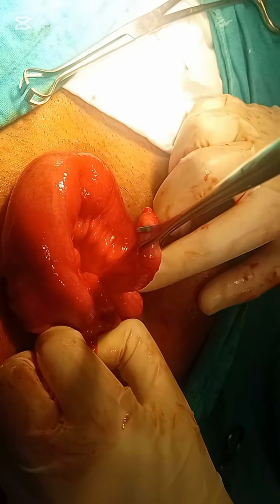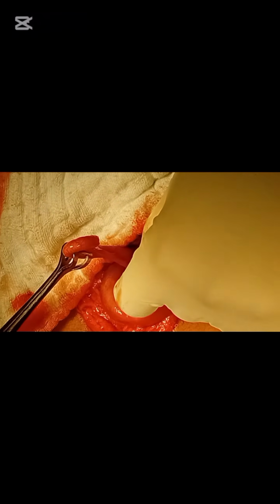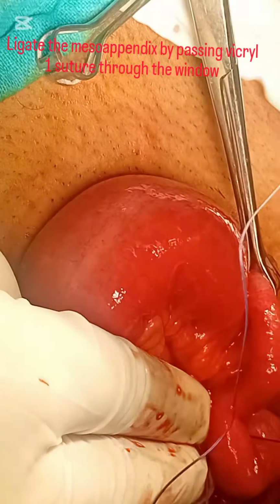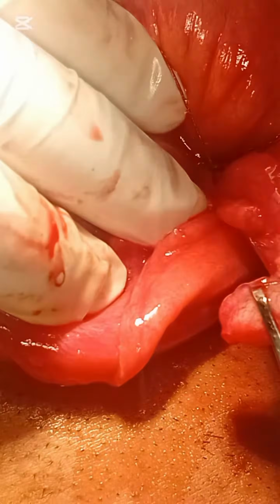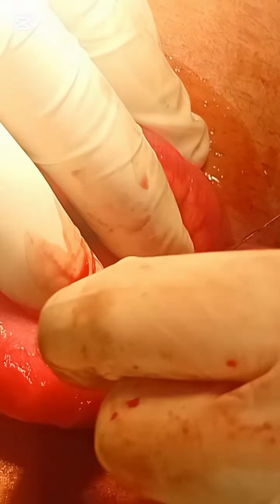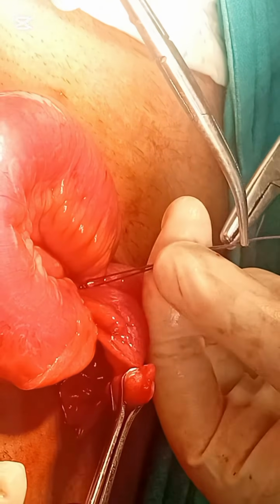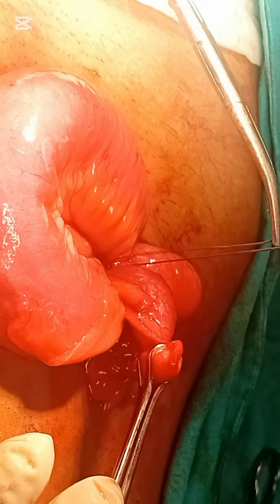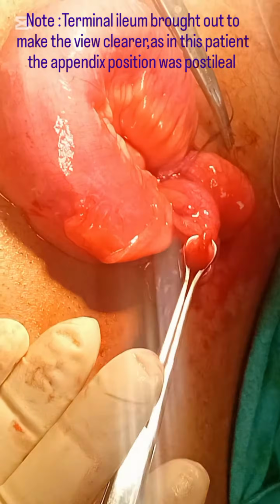Now the appendix is outside and we are holding it with Babcock. Ligate the mesoappendix by making a window from the appendix base to the mesentery and tie it with Vicryl 1, so that the artery of the appendix, also known as the appendicular artery, in the mesoappendix shall be ligated and bleeding is secured. Do not cut the thread at all, just clamp it with artery forceps and use it as a lead point if any hemorrhage from the mesoappendix occurs.